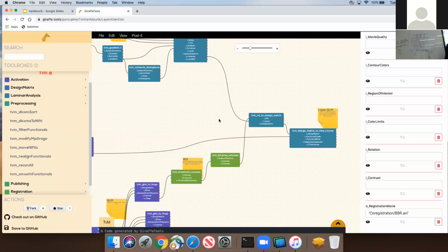It seems that you could almost separate out 3 layers, but this technique just gives you a little bit better unmixing of the signals, without really trying to take your 0.8 millimeter voxels and infer layers that are 0.4 millimeters thick, trying to separate out 6 layers from those data. So I like this idea that it's able to perform a little bit of unmixing without being so aggressive as to form super resolution.